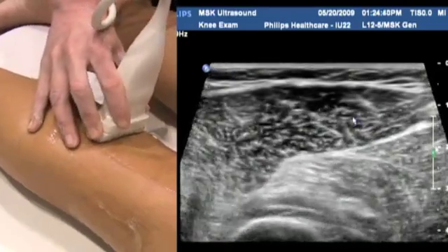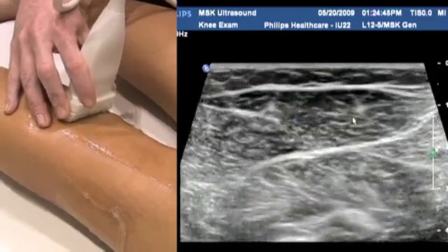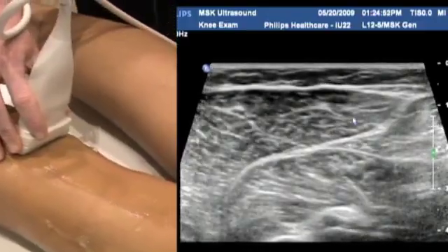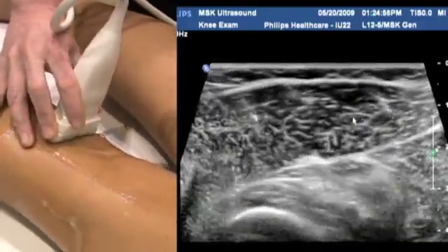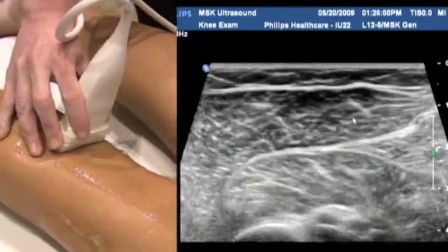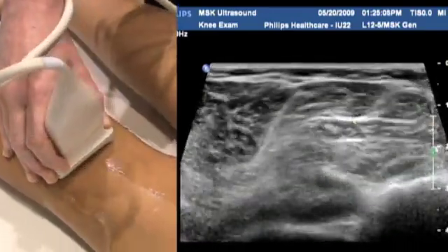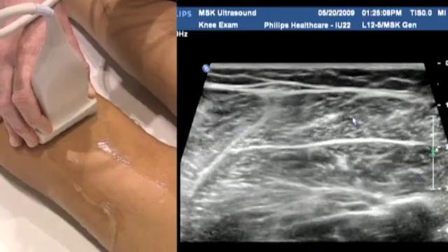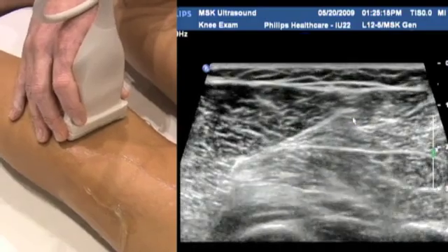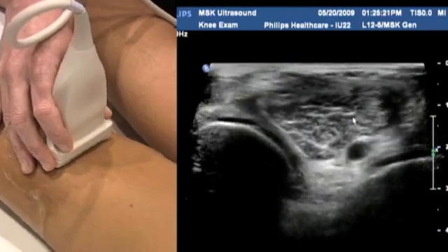The veins contained within the muscle that you can see compressing there are easily compressible. That's another cause of calf pain, is thrombosis in the muscular veins, not necessarily the deep veins. So it's important to cover that also. But again, you can see how lovely and homogeneous these muscles are. There's no areas of increased signal, no areas of edema, or the other way, when a muscle starts to atrophy and lose its bulk, something to be aware of. And that's our basic knee exam.